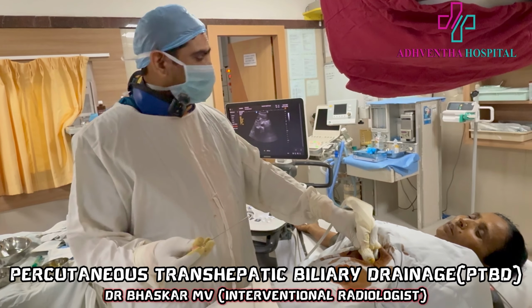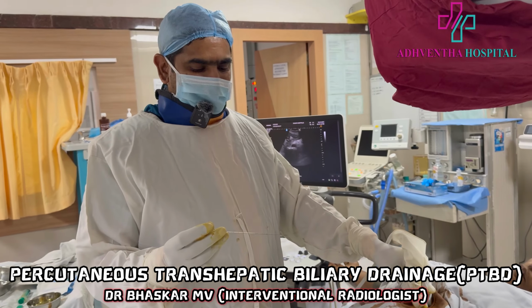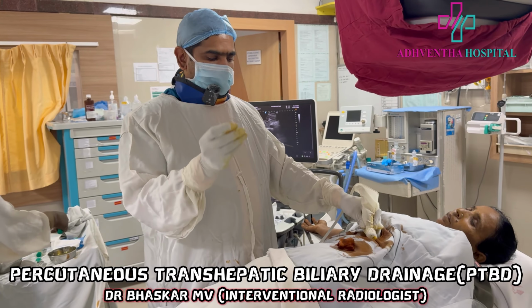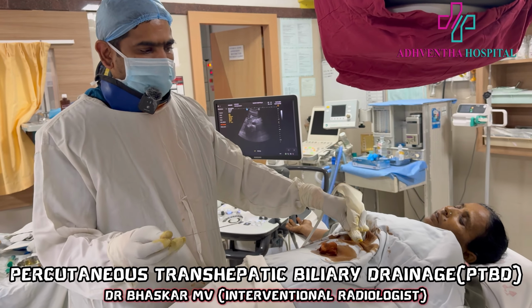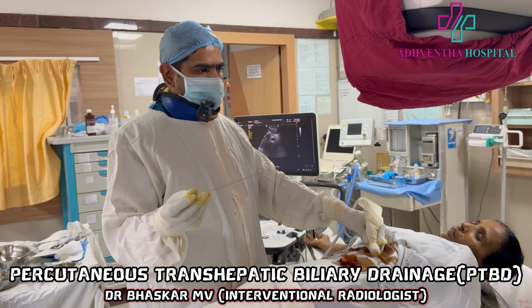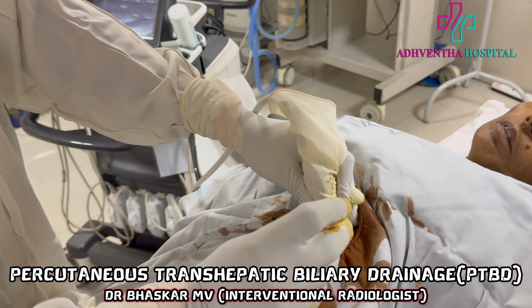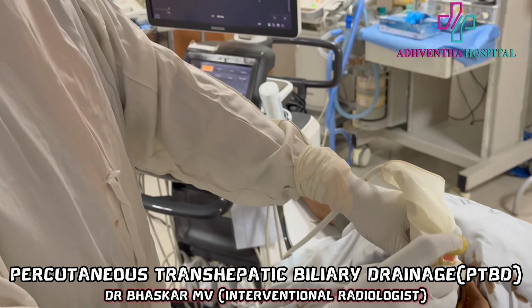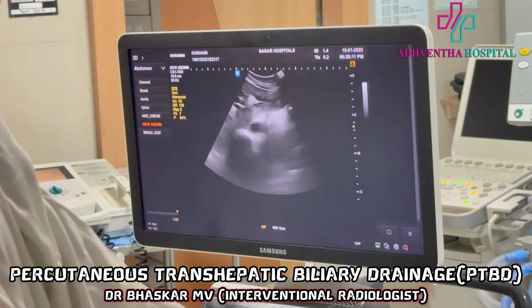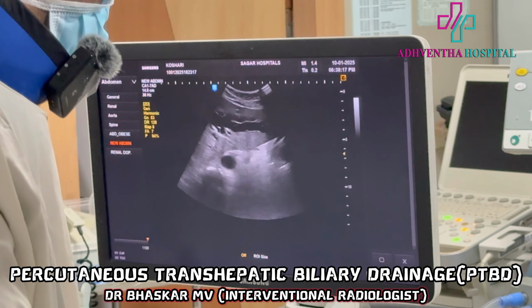The advantage of this is since it is a very gross dilatation, there is no need for a smaller needle to puncture and exchange with a bigger sized catheter. So we can directly put the Chiba needle into the biliary radical, opacify by doing a cholangiogram, and then you can take the wire directly. So accurately we have to puncture the biliary radicals. See, that is the needle. Can you see this? I'll show this with a magnification by increasing the depth.